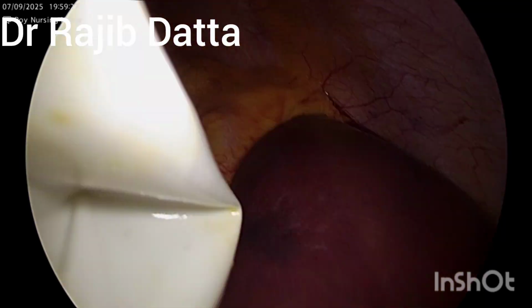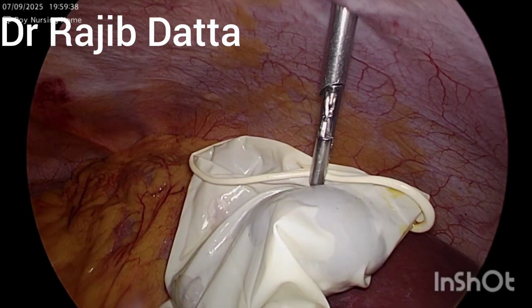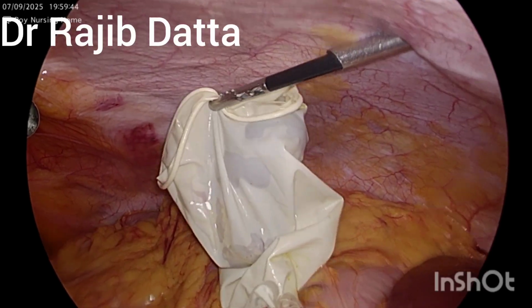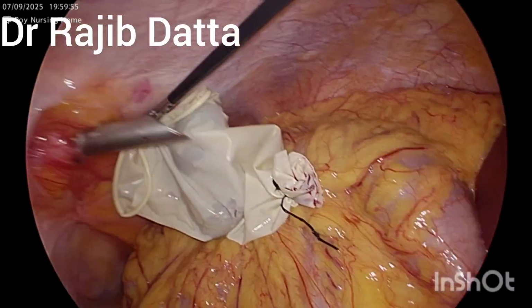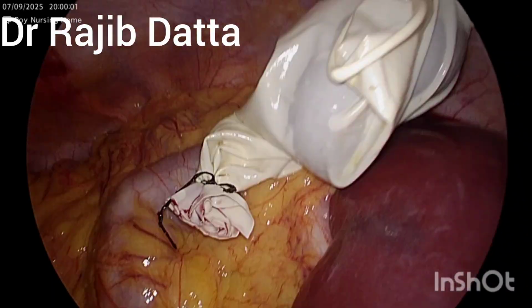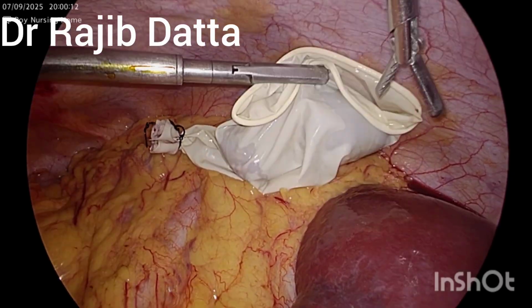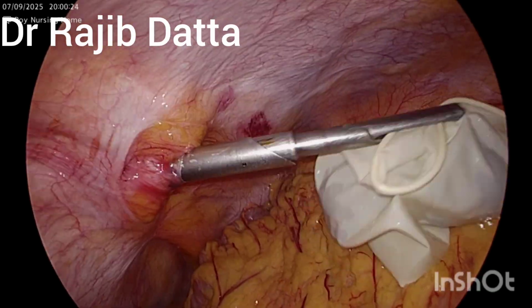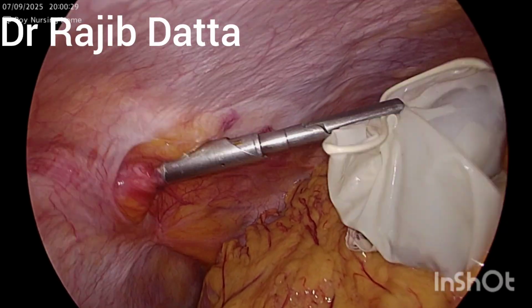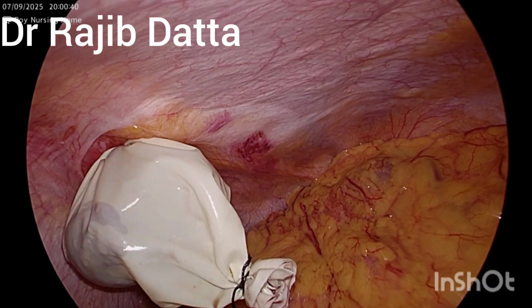So our telescope has now been introduced to the mid-epigastric port, and the gallbladder with the endo bag as a whole will be retrieved out through the umbilical port. So the crocodile forceps, or gallbladder extraction forceps, is in, and the gallbladder along with the 10 mm port has been retrieved out through the umbilical port, and the gallbladder has been positioned in such a way that there will be no transverse arrest of the gallbladder.